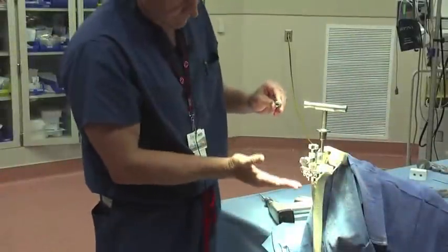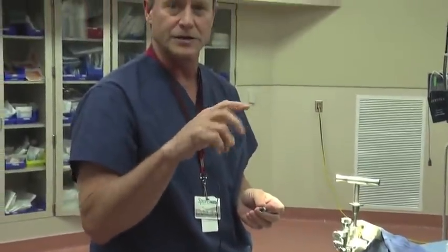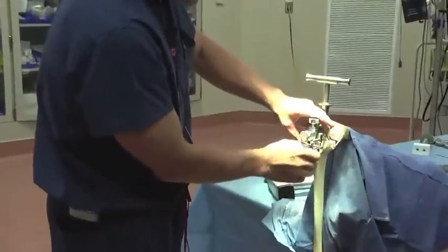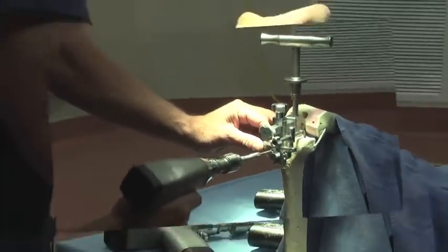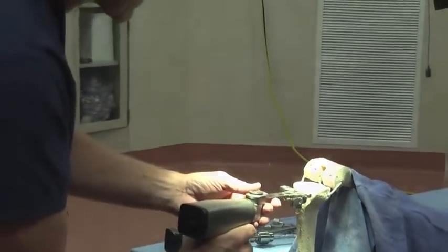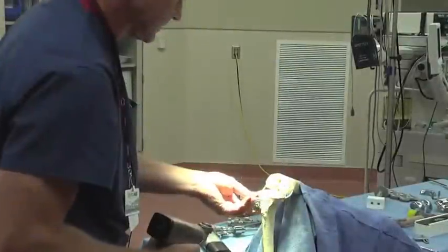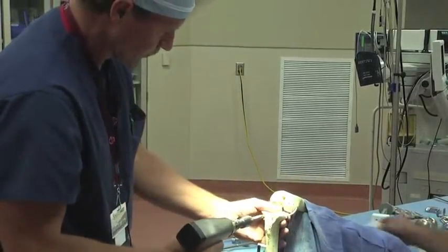We want to determine how far down the tibia we're going to make the cut. Usually all we're trying to do with these implants is, when we make our cuts, make enough cut on the bone to get the implant in to the level that we want. When we get to that height, we want to lock that in, and then we'll go ahead and place our pins again. Usually we're doing a pretty flat cut here with just a little bit of slope to the back. Then the block will come back off and we'll go ahead and remove our pins.